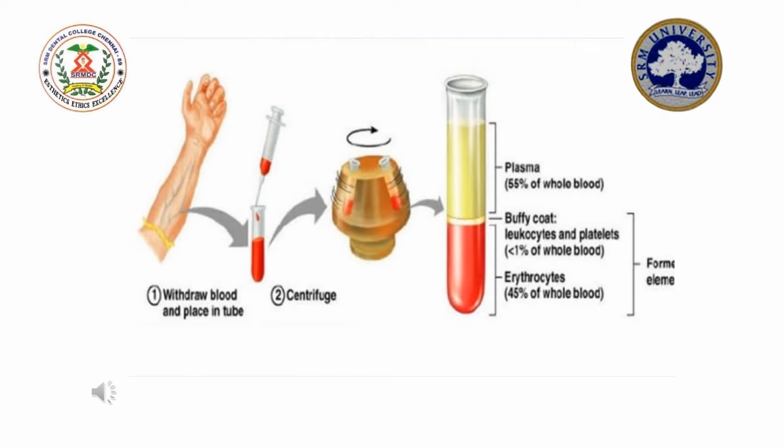Now coming to the various methods, to start with the Wintrobe's method. In the Wintrobe's method, the blood is collected in an EDTA vial. The blood is anticoagulated blood and the sample is mixed thoroughly so that the plasma content and the solid RBC cell content properly mix.